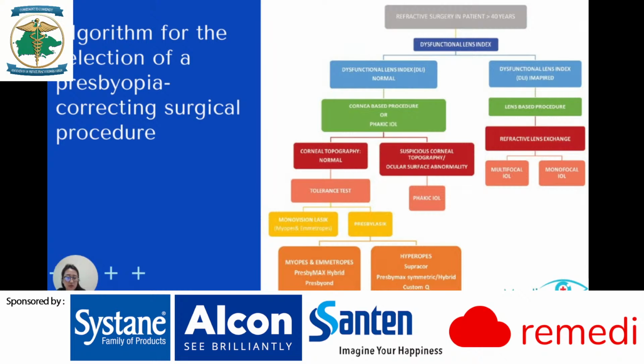Depending on the corneal topography of the patient, if it's normal, patient will most likely be counseled to go for a monovision LASIK or a Presby LASIK. And if the corneal topography is abnormal or suspicious, patient will be counseled to go for a phakic intraocular lens procedure.